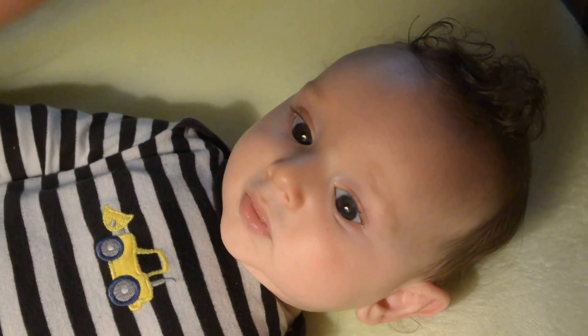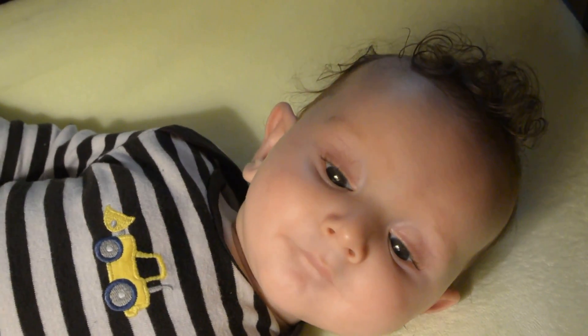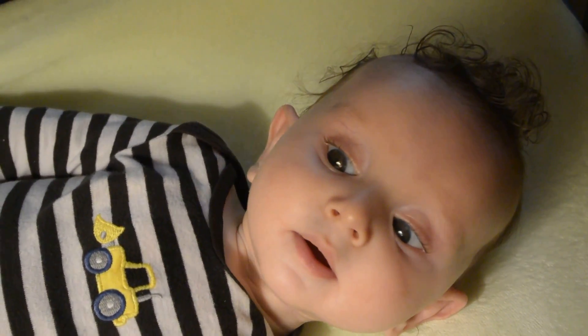Currently I like to use a plunger to put his contacts in. You can buy these on Amazon.com or get them from your optician. I found they are pretty handy and I like this method over just putting them in using the fold method — like folding it like a taco. So I prefer to use this plunger and it works very well.